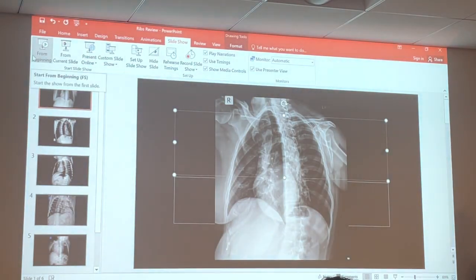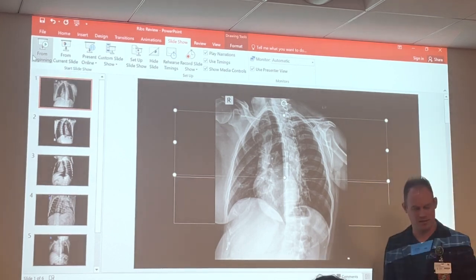All right, so here's what I want y'all to do now, guys, because it's actually going to help you if you can talk it out and actually put it into practice. I want you to pair up or get in threes and position each other on a wall, going through all four of those obliques. As you do it, I want you to state what side's touching, what's elongated, and what marker you use. That's going to help you. So get in groups, and I want you to run through that.